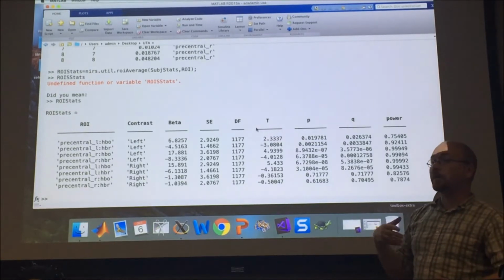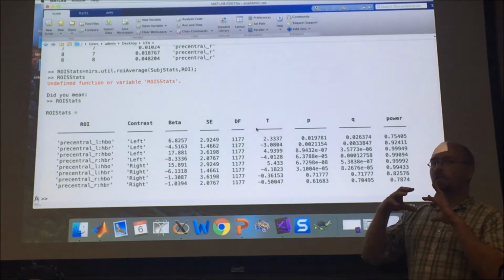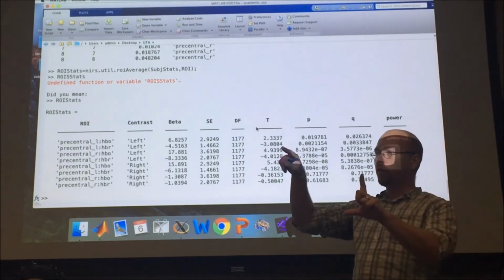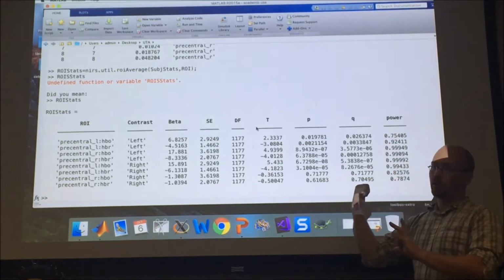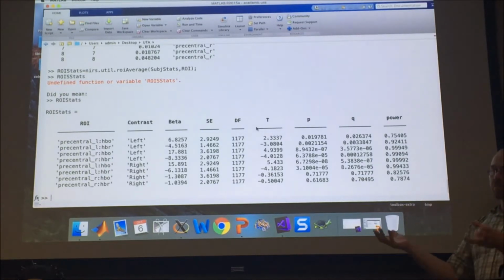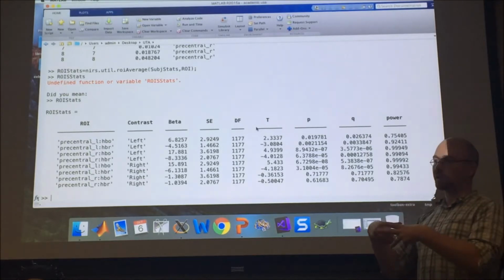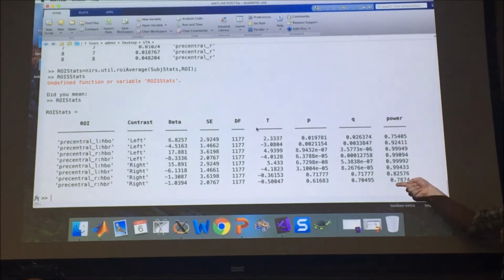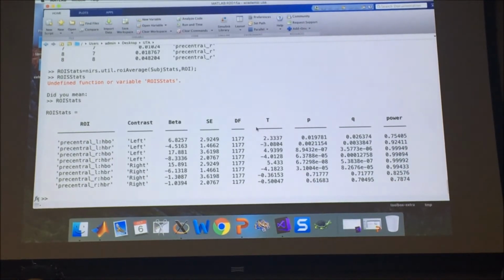When we run these region of interest analyses like this, it works because my stats model at the first level knew all about the channel by channel relationships, that these two channels were not independent. That's actually taken into account when I do this. So when I average multiple channels together, I'm able to acknowledge the fact that they weren't actually independent measures and correct for it. And you see, actually, your power goes way up because you're averaging lots of channels together.